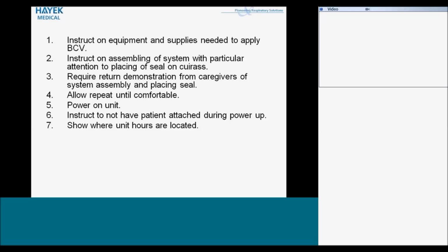Make sure they understand not to have it on the patient when it powers up. Also, as it's powering up, there is a box that appears for a few seconds that has the unit hours on there. At some point, they may be contacted by the home office to find out what the hours are on the machine, and we want them to know where the hours are located.